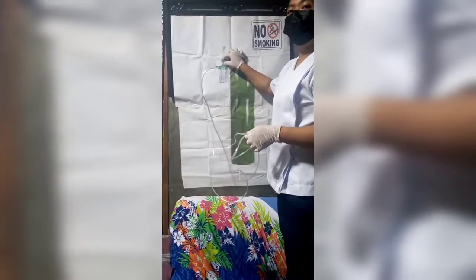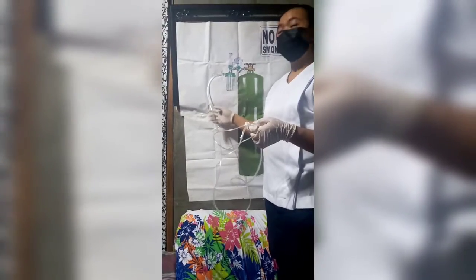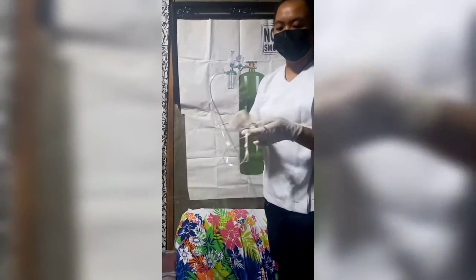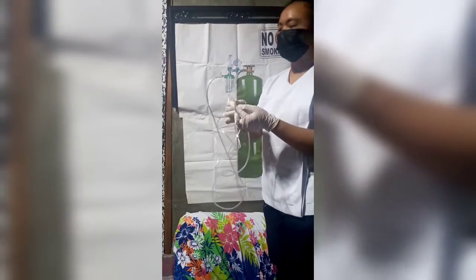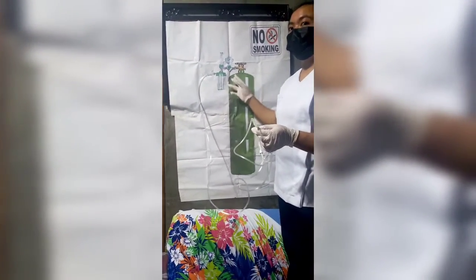Adjust the flow rate as ordered. Check that oxygen is flowing out of the prongs. This is the prongs, so you need to check if the oxygen is flowing. We can also observe the water in the humidifying cup forming bubbles.